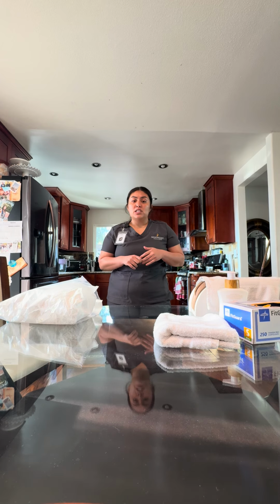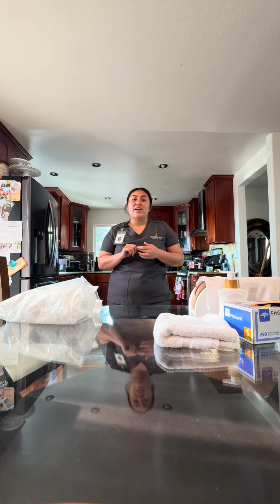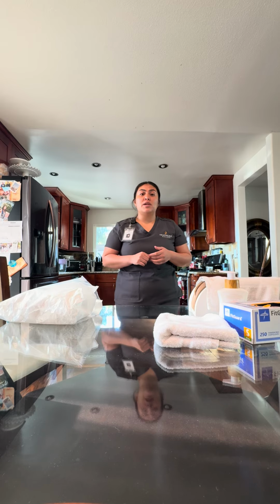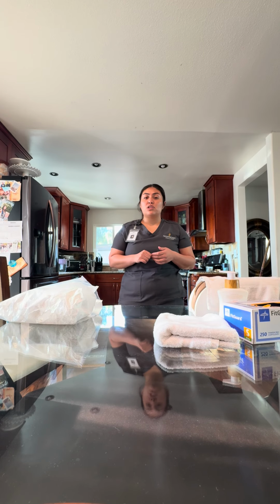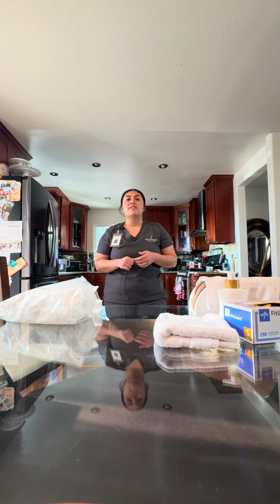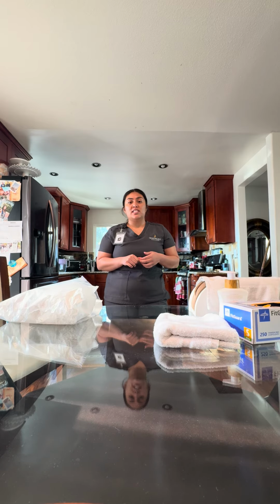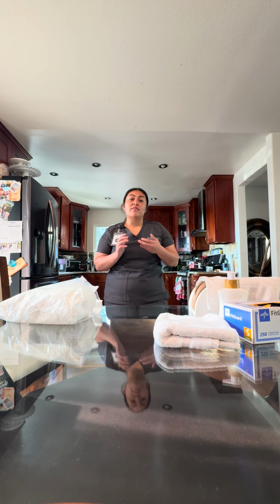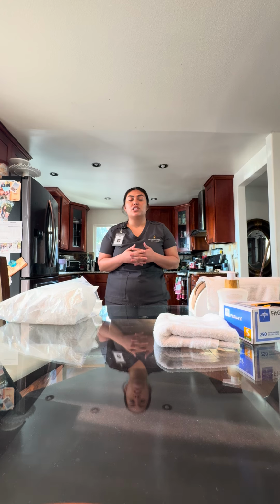Therefore, before entering the patient's room, I have performed hand hygiene and checked for patient safety. I have knocked on my patient's door, entered the room, and closed the door behind me for patient privacy. I have introduced myself and let the patient know that the doctor has ordered an insertion of a Foley catheter to be placed today. I have obtained two patient identifiers, checked for allergies, and explained the procedure to my patient and how long it will take.